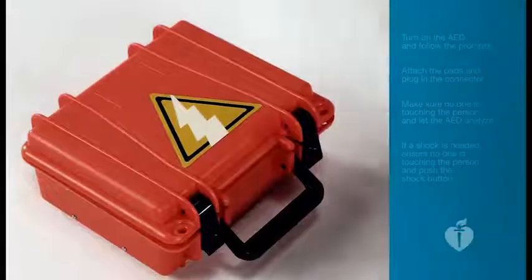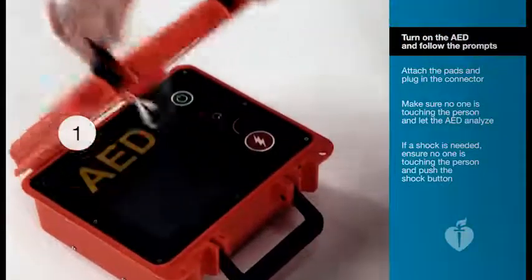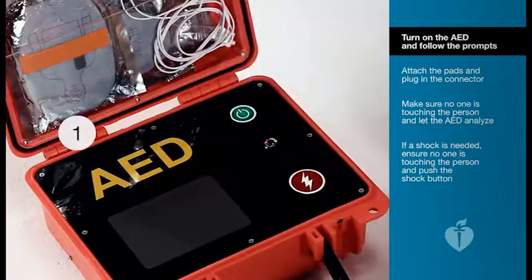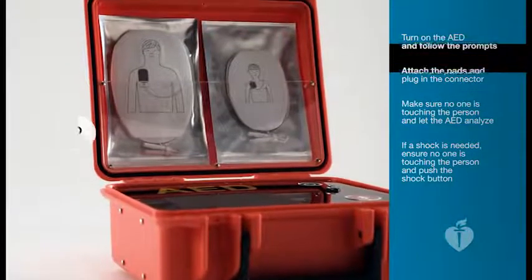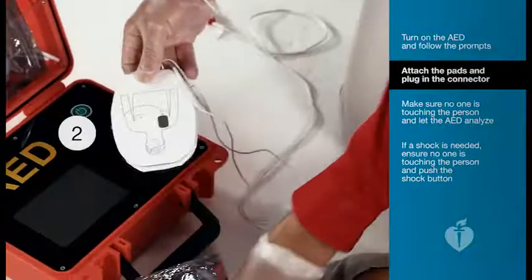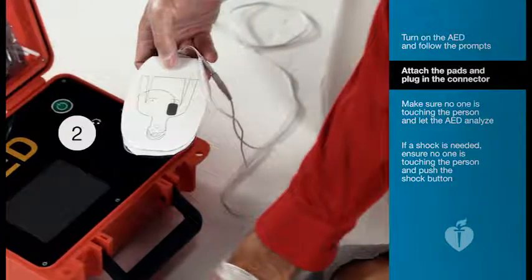To use an AED, you simply turn it on by either pushing the on button or lifting the lid. Once you turn on the AED, you'll hear prompts telling you everything you need to do. AEDs can be used for children and infants. Many AEDs have pads for children, or a child pad cable system or a key. If there are no child pads, or if there isn't a child key or switch, use the adult pads. Also, if the child is 8 years of age or older, use adult pads.